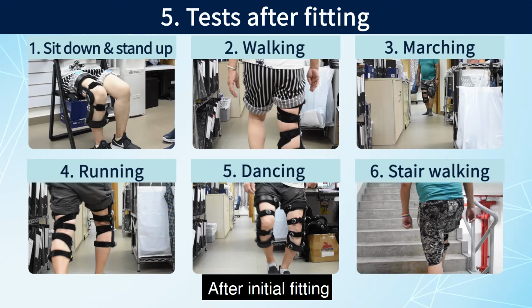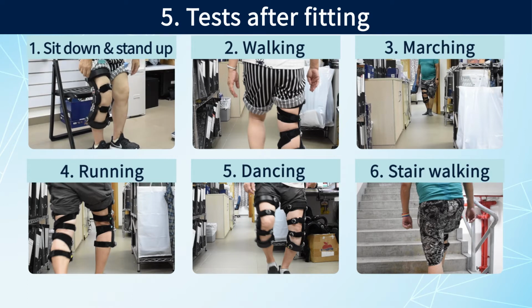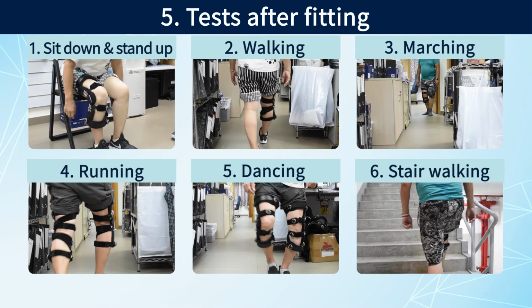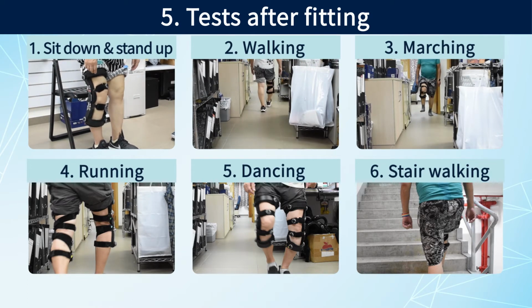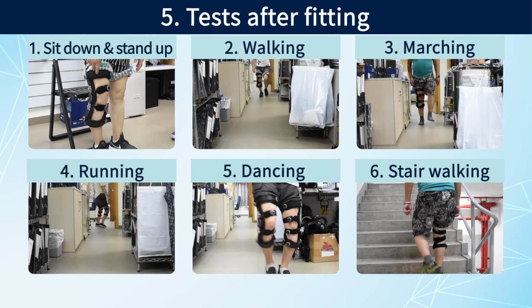5. After initial fitting, the therapist needs to test the function of the brace as listed below. 1. Sit down and stand up. 2. Walking. 3. Marching. 4. Running. 5. Dancing. 6. Stair walking.